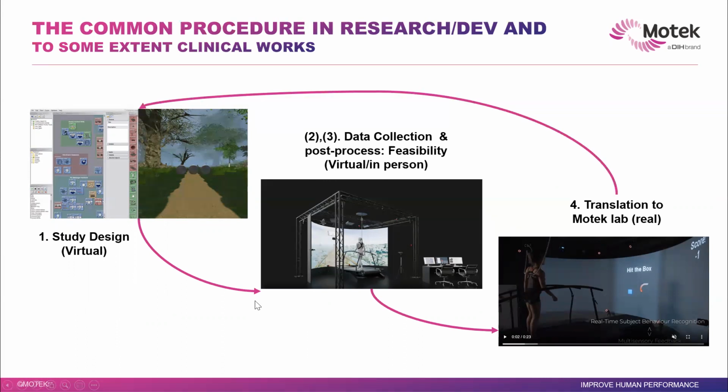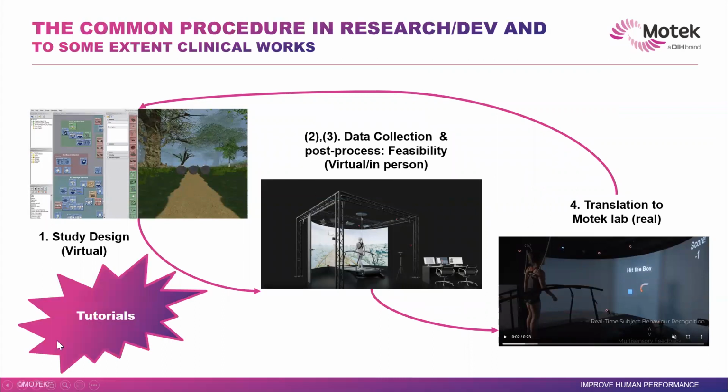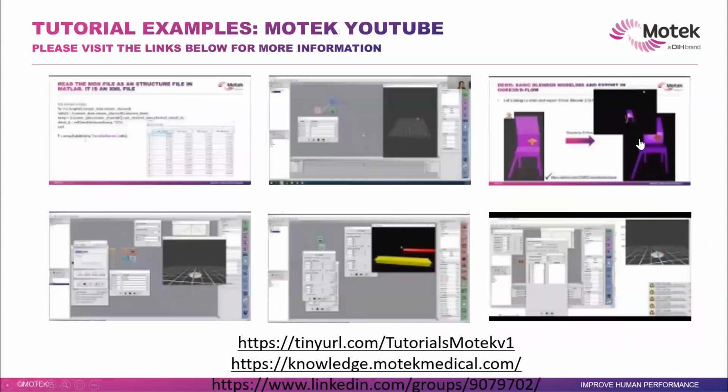This is usually an ongoing process; it's not going to finish this way, right? So the purpose of our video tutorials is just around this part, which is more of an emulator. We are using our system and our software to help you understand what the possibilities are. And please feel free to get back to us with any comments or suggestions that you may have.